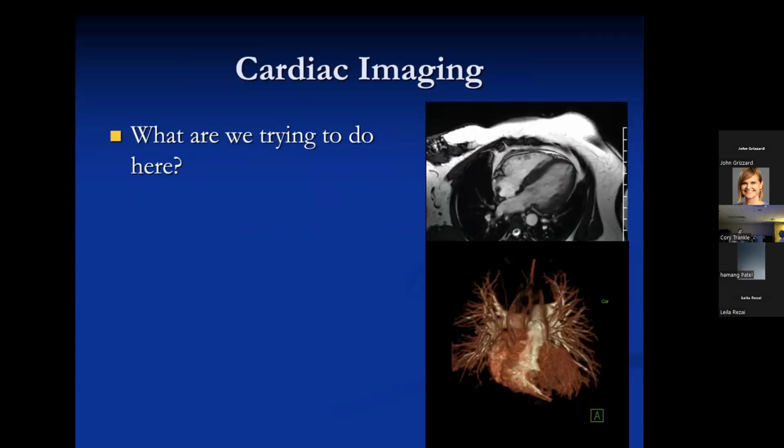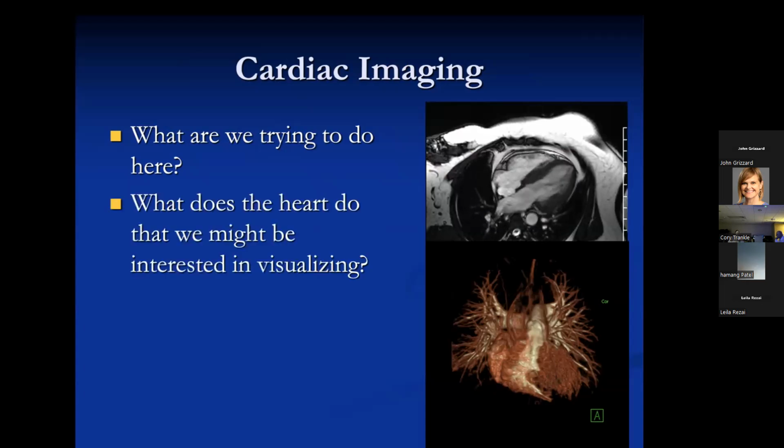So I think it's useful when you're thinking about this to go back to the beginning and pretend that you were inventing MR. So what are we trying to do exactly with this? What does the heart do that we want to be able to understand or visualize?